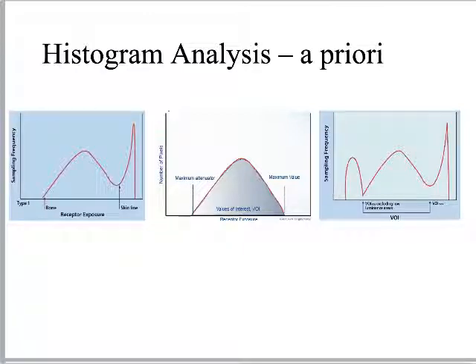It just knows that all chest x-ray histograms should look like this bell curve, period. If I'm doing the makeup for model A, I just know that all the makeup jobs should wind up looking like model A, period. I'm not worried about what color dress or anything that the person's wearing.